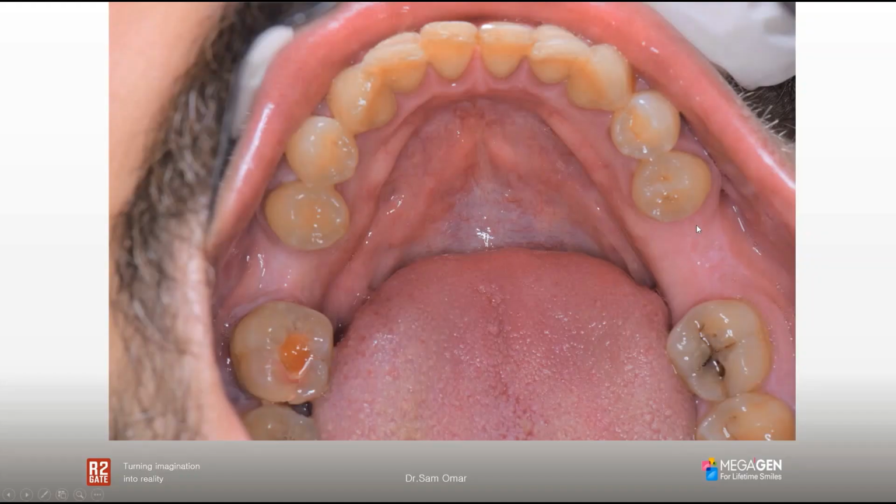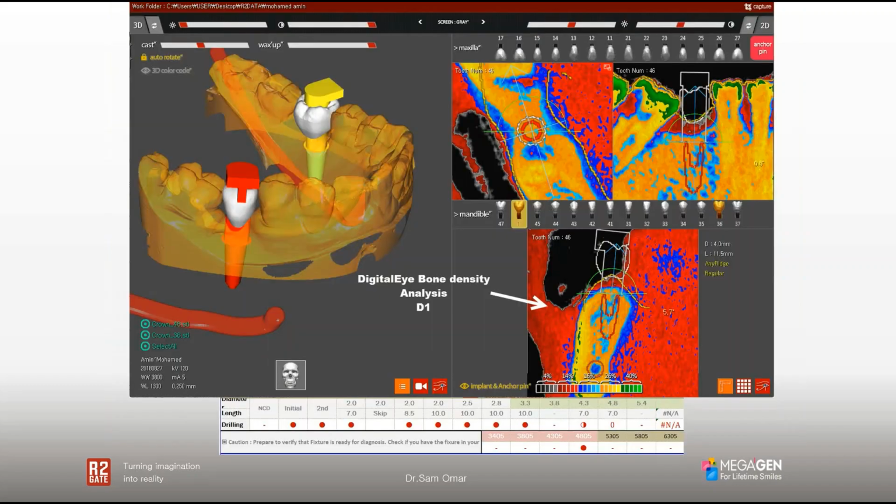Even though this type of tissue was actually keratinized tissue, the decision to punch or flap the tissue is really based on the quality and the quantity of the tissue together. By quality, we mean is the tissue keratinized or not, and by quantity, we mean how thick is the soft tissue. If the soft tissue is thin to begin with, do not punch the tissue. We would recommend that you do a flap in this case. So in this case, I decided to do a flap.